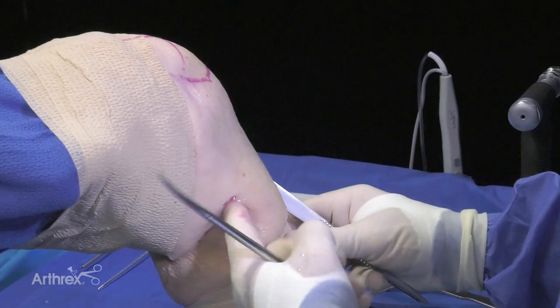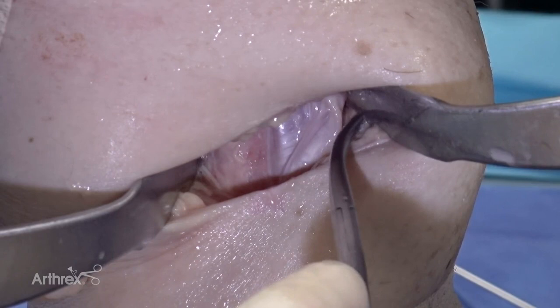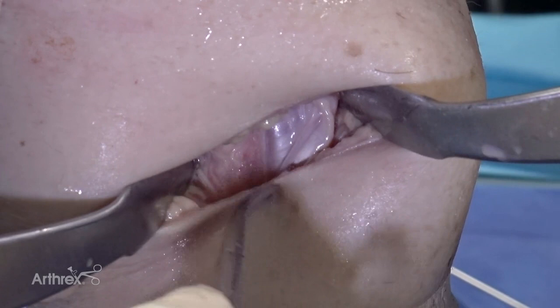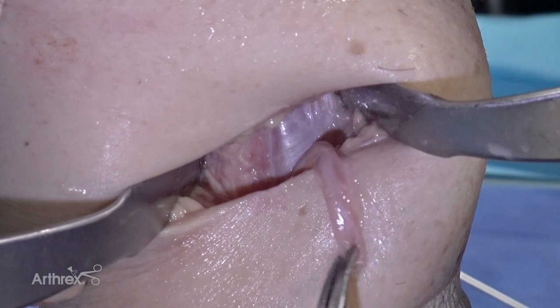We have one retractor underneath the deltoid where at the confluence of the pec, which is coming across underneath the deltoid here. You know that if the pec insertion is here and you're medial to it, that just along the length of the humerus will be the biceps. Medially, we take great care with a pointed or blunt retractor along the humerus just to hold things just above the latissimus out of the way, always keeping it perpendicular. And then we can just take a curved snap to retrieve the biceps from distal to proximal where it's been tenotomized. Just place a snap on the tendon.